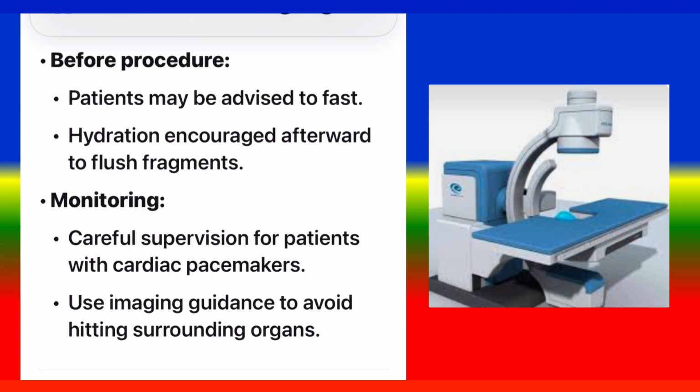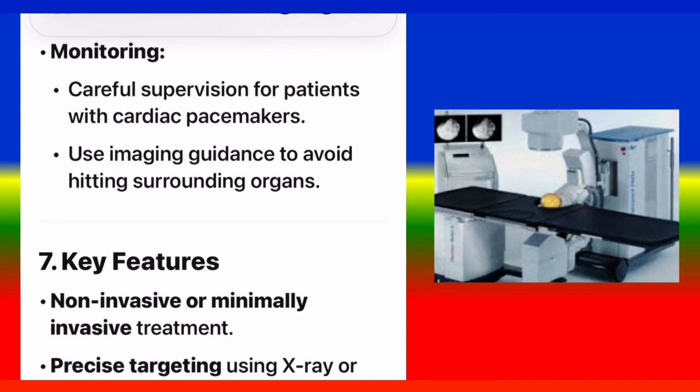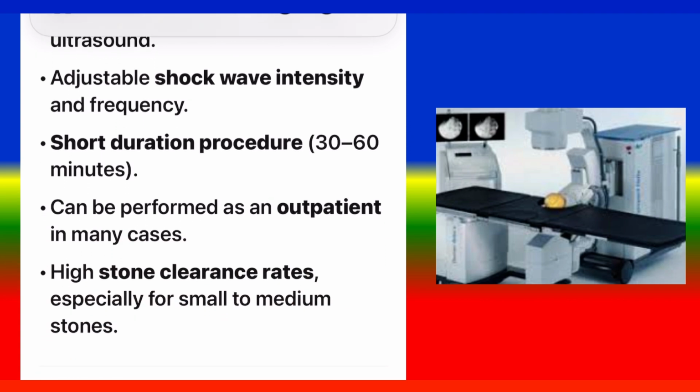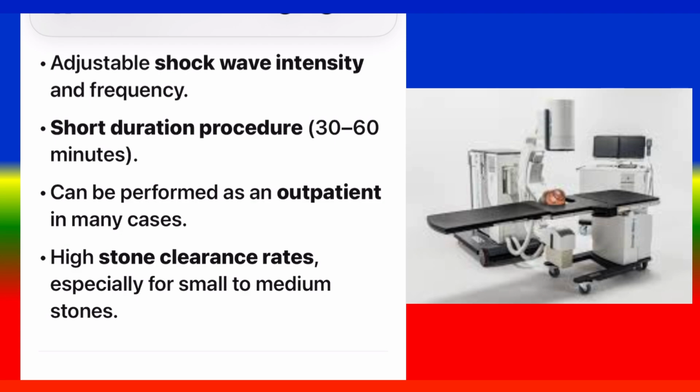Monitoring. Careful supervision for patients with cardiac pacemakers. Use imaging guidance to avoid hitting surrounding organs. 7. Key features. Non-invasive or minimally invasive treatment. Precise targeting using X-ray or ultrasound. Adjustable shock wave intensity and frequency. Short duration procedure, 30 to 60 minutes. Can be performed as an outpatient in many cases. High stone clearance rates, especially for small to medium stones.